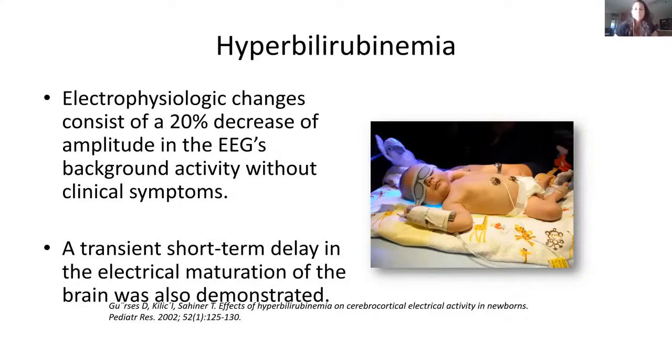I'd used it in the past when babies with hyperbilly would come in with funny movements, or just funny posturing, and I couldn't tell if it was just related to the hyperbilly or if they had something else going on, infectious or meningitic. So I had used it in the past to rule out seizures, not really thinking about it so much as neuronal dysfunction and depression.